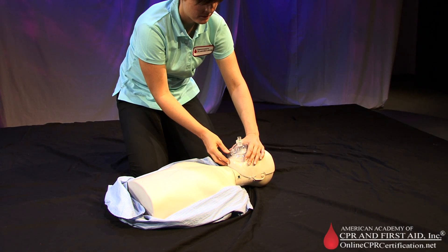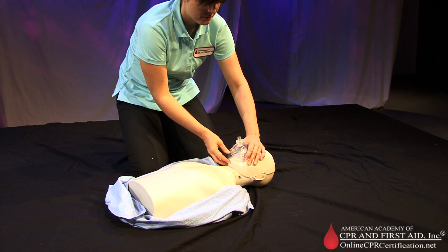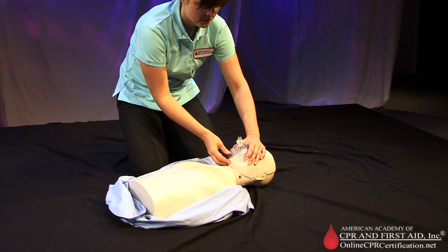For children, give one breath every three to five seconds for a rate of 12 to 20 breaths per minute.